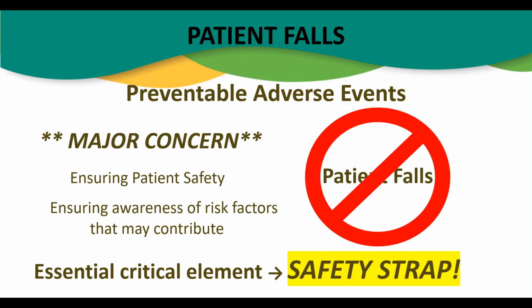I've seen surgeons argue about having a safety strap. I don't like the buckle. The buckle's in my way. But we have ones that go under the table cover. All that education, and you're worried about a buckle. I mean, come on. Well, we can't put it across the chest or the belt. If we're putting it on correctly, it's not constraining anything. It's really not, but that's a conversation. I mean, that's crazy.